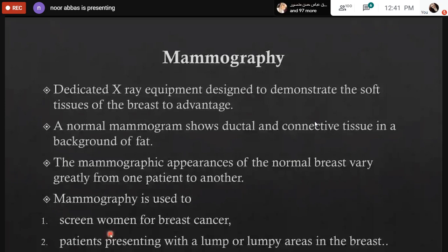كل ما زادت density of the breast كل ما قلت sensitivity of detection، وكل ما قلت density كان الماموغرافي more sensitive. Okay, about mammography for what? This is the reason why I call it a lesion. ليش ما أقول عليها lesion? Abnormality, suspicious abnormality, راح تكون mass وتكون calcification.